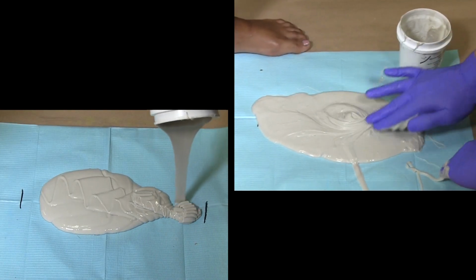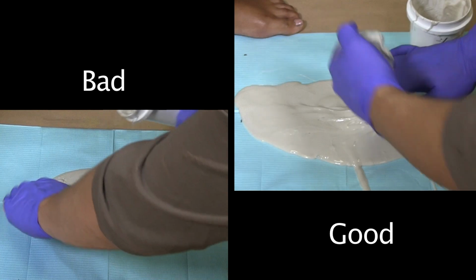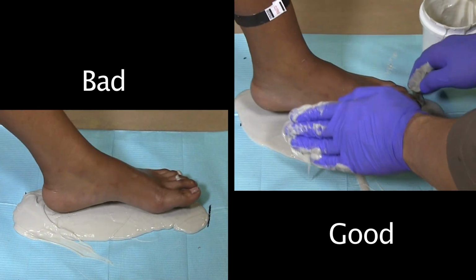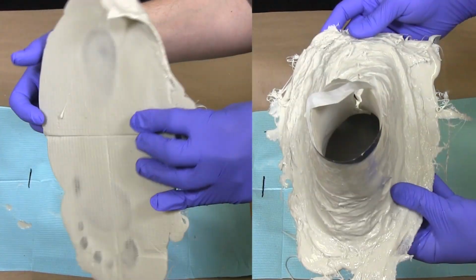Make sure the base of the impression material is tacky to the touch before placing the customer's foot. Doing so too soon will result in an impression that is too thin on the bottom.